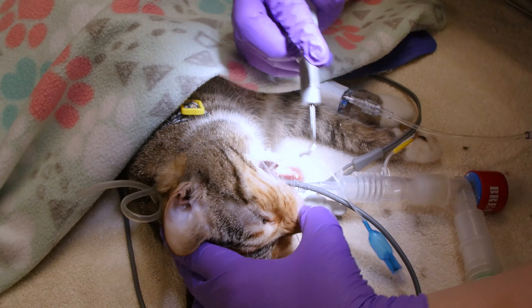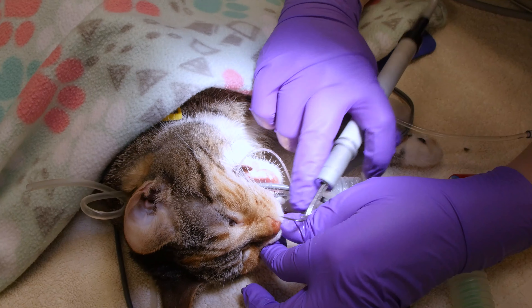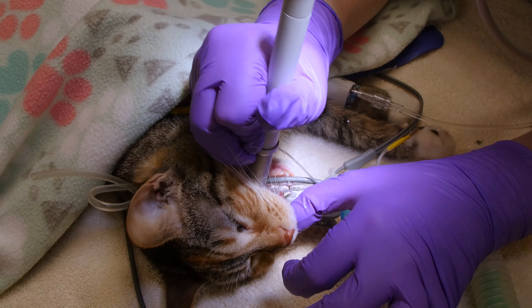Using an ultrasonic scaler, we clean your pet's teeth. The ultrasonic scaler allows us to thoroughly remove plaque and tartar from the teeth, minimizing anesthetic time, and allows us to clean under the gum line as well.